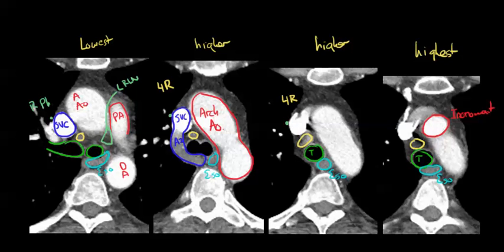The SVC is now splitting — superior vena cava — starting to split into the brachiocephalic on the left, so this is the left brachiocephalic, and this is going to become the right brachiocephalic. You still have your mammaries right up in here, riding right next to the sternum.